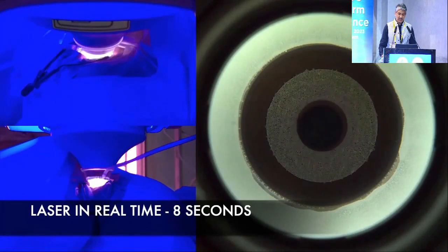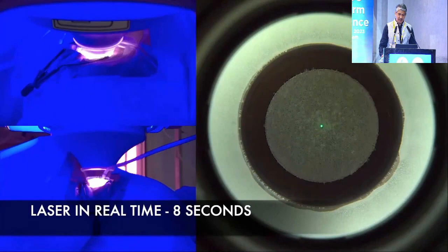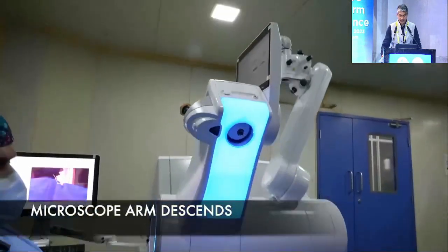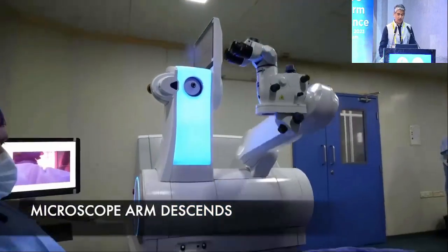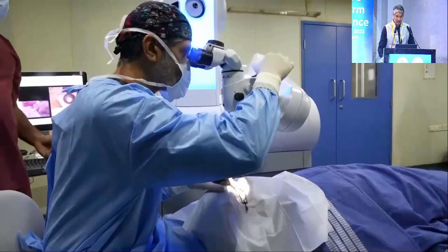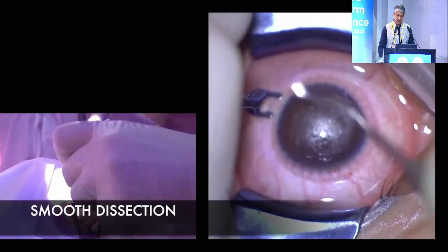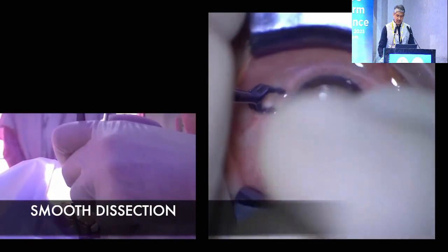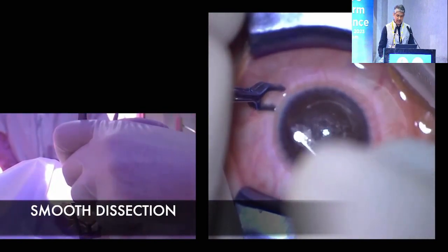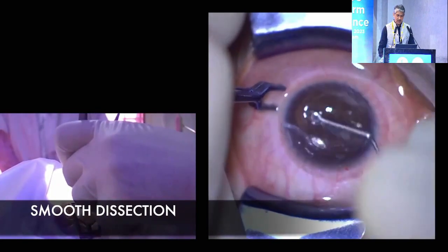And the laser itself is much faster. It is a 2 megahertz laser. So the laser in real time takes about 8 seconds for a 6 mm zone and 10 seconds for a 6.5 mm zone. The laser arm goes up and the microscope arm comes down. It's robotic arms, and you can see that is the dissection. The laser pattern itself is very nice without OBL, and then you have a smooth dissection. So the treatment time is greatly reduced.